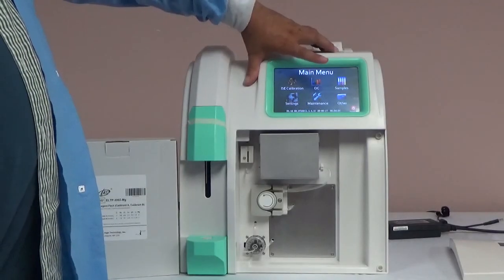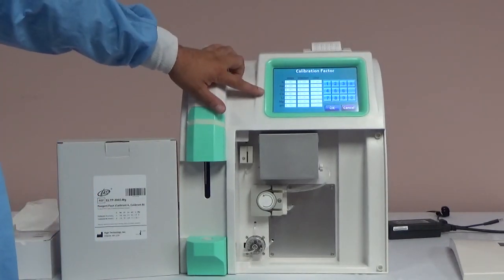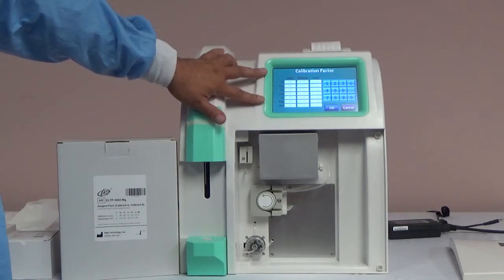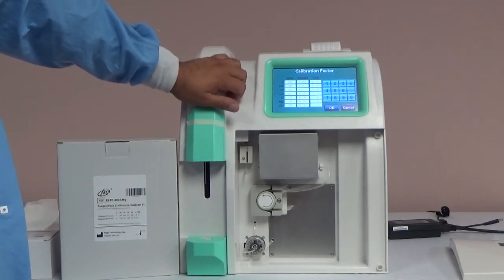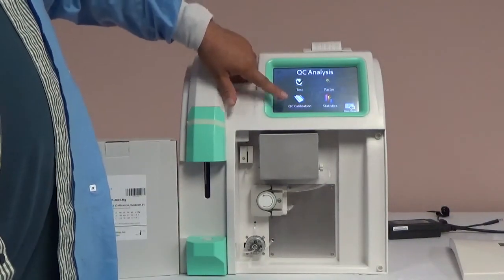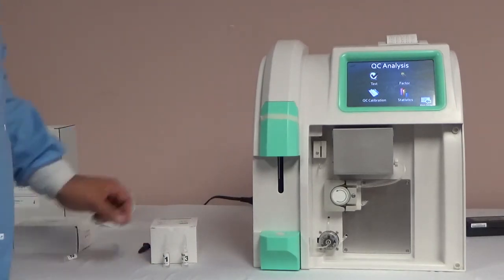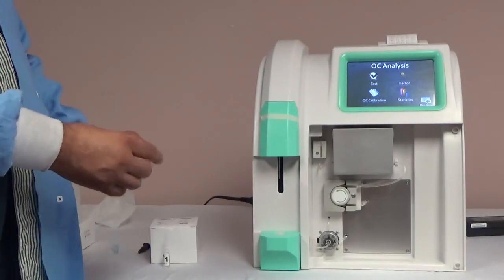After the ISE calibration is complete, you can begin quality control. Quality control can be accessed from the main menu and then QC. For international customers, verify that the factors are already entered by selecting Factor on the QC analysis screen. For customers that do not already have factors programmed into their analyzer, a QC calibration will need to be run. For international customers, the QC calibration will be run any time you notice a drift in your results, even if only one parameter is off. To do QC calibration, you will need linearity control material. The linearity control material includes levels 1, 2, and 3, but you will only need levels 1 and 3 for the QC calibration. To prep the solutions, shake the bottle, flick the top, and snap the top off.